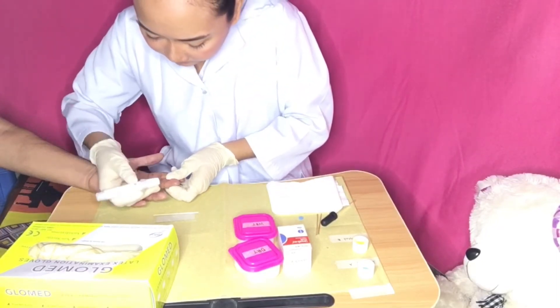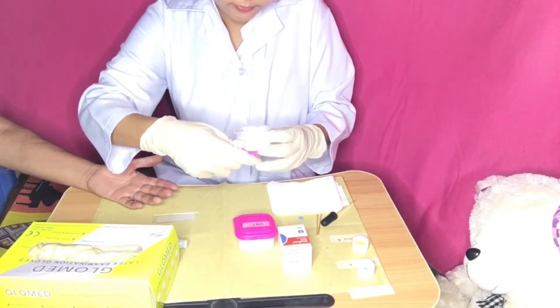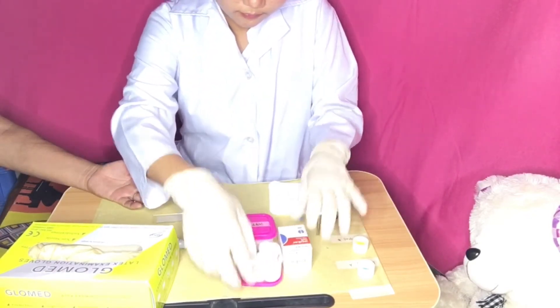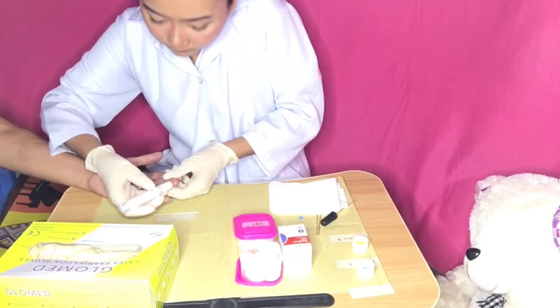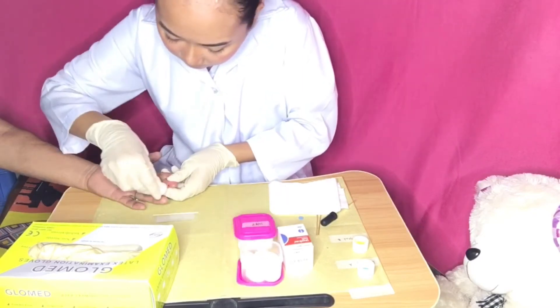Put the gloves on. Pierce the site with the lancet or needle using a dart-like motion. Wipe away the first drop of blood with a cotton ball, then gently squeeze but do not touch the puncture site until a large drop of blood forms.